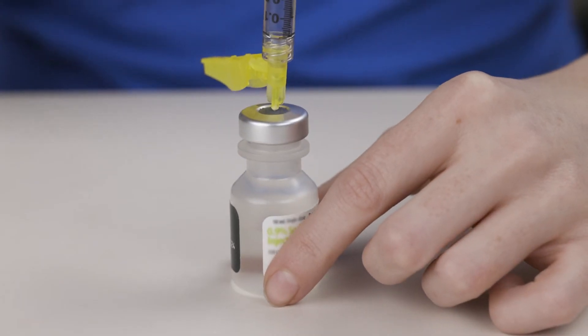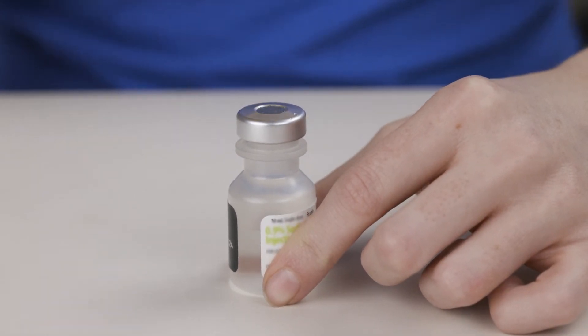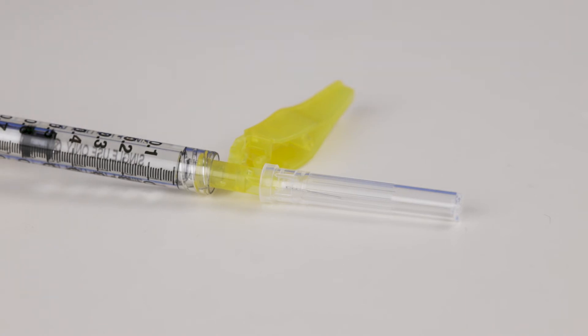Turn the vial upright and remove the needle. Rest the syringe in the needle cap and on a clean surface as you prepare your injection site.